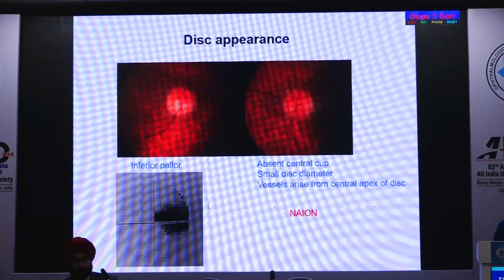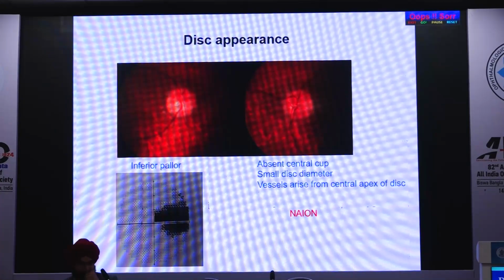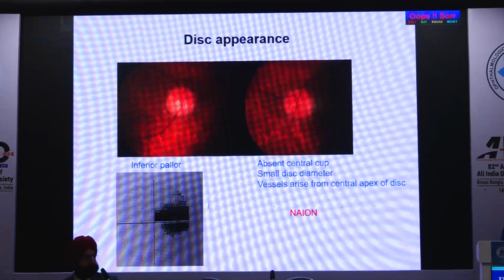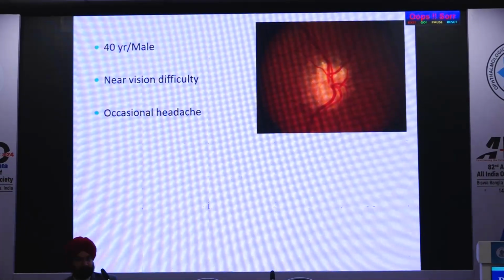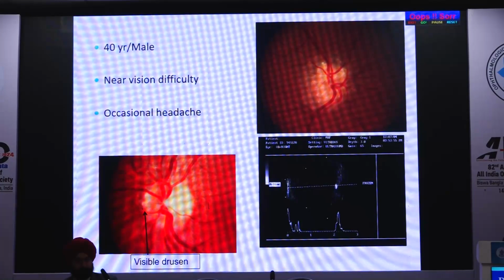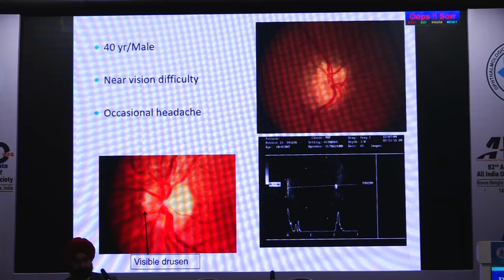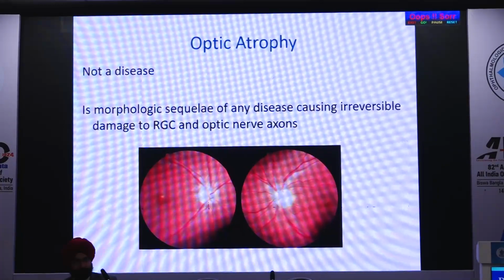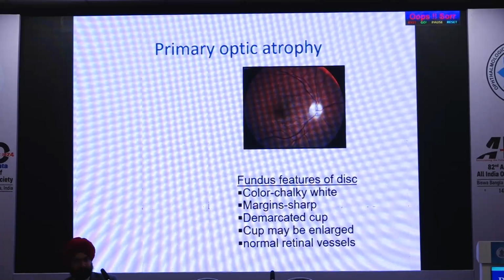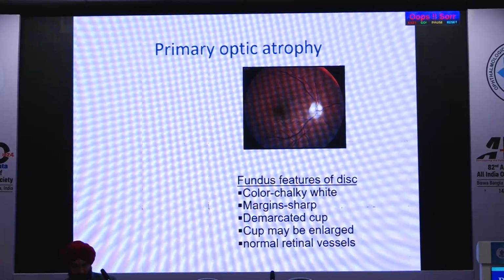Just to show you another ischemic optic neuropathy, you can see a very small sectoral involvement. You can see that the disc is just sectorally involved, and the other eye is a small disc with an absent cup. So these are conditions, again, another appearance of a disc edema. We talked about Drusen in the previous OCT picture, but that's what you need to look out for: true versus pseudo disc edema. And in optic atrophy, you can differentiate primary versus secondary, giving us a little etiology based idea.